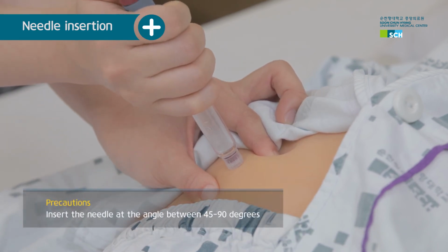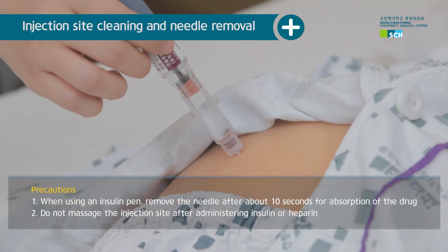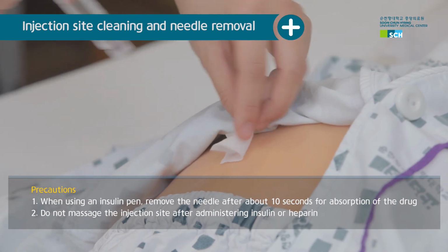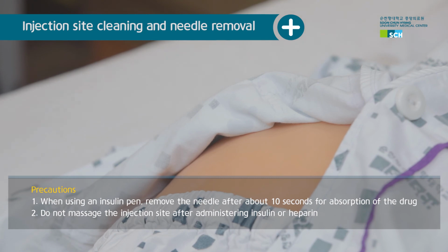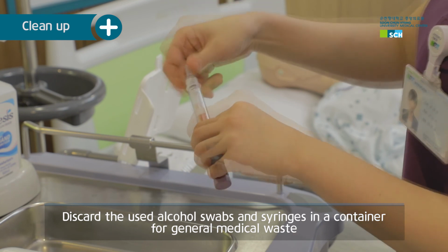Lift the skin between thumb and index finger with one hand to tighten the skin layer. Insert the needle at the angle between 45 to 90 degrees and press the injection button. When the injection is finished, remove the needle in the same direction as it was pushed. Press the injection site with alcohol swabs gently, but do not massage. Put the cap on the end of the needle and unscrew the needle from the pen.